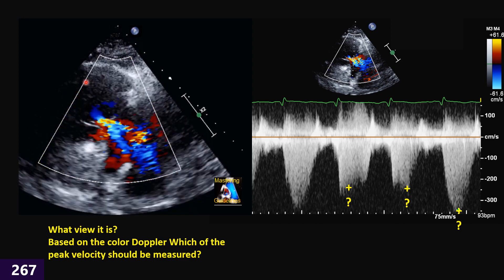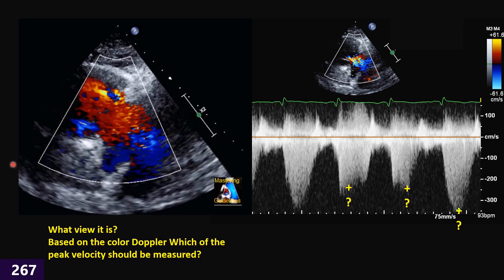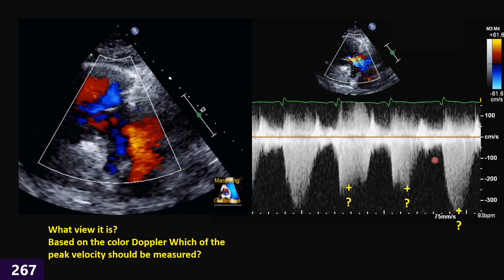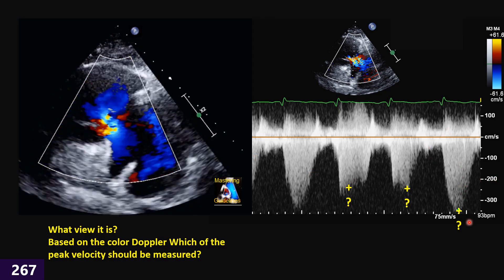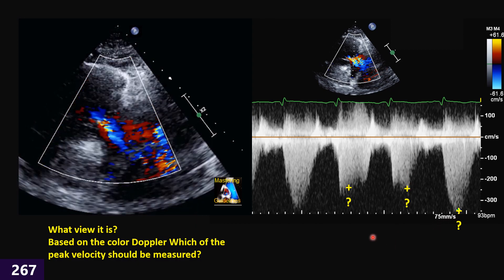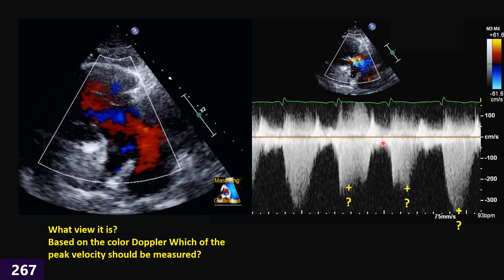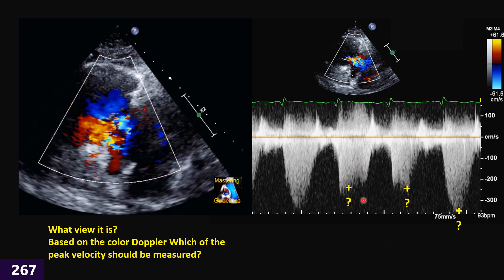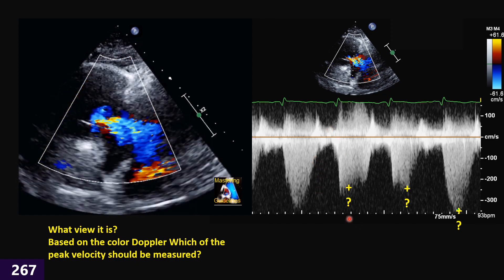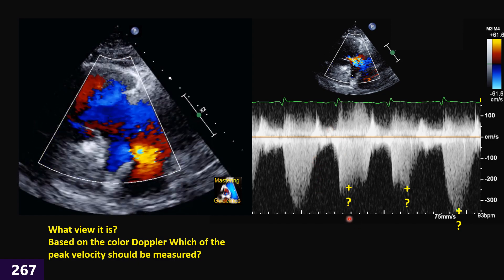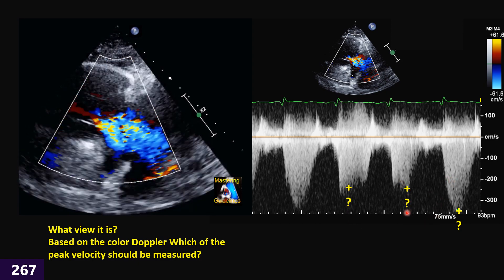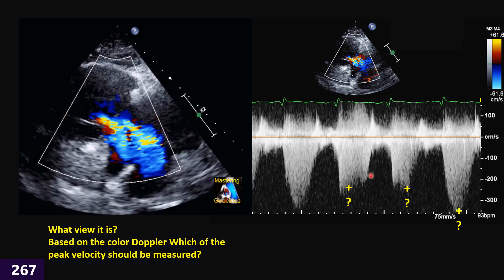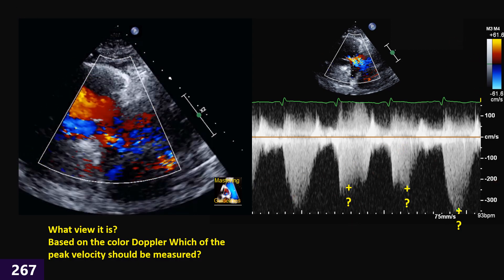Here we have a case. First, which view is this? Second, we do Doppler on that view — you have to identify it — and we get this Doppler. For measuring the peak pressure gradient, which one do we use: this one, this one, this one, or all of them and we calculate the average? For any option you choose, you have to explain why — why you chose each of them or all of them, and which is the better and correct way based on this color Doppler, ECHO, and all findings we have here.